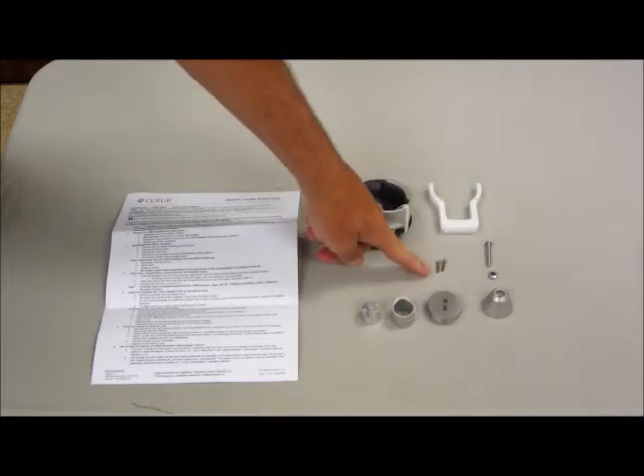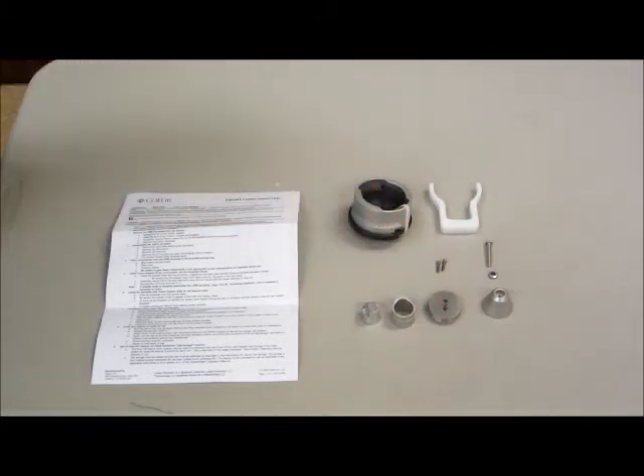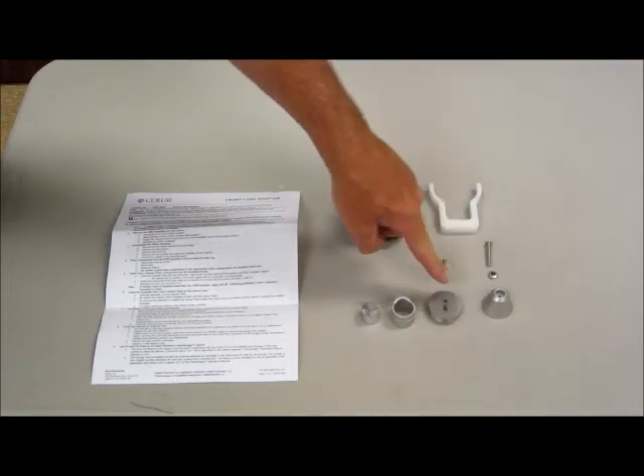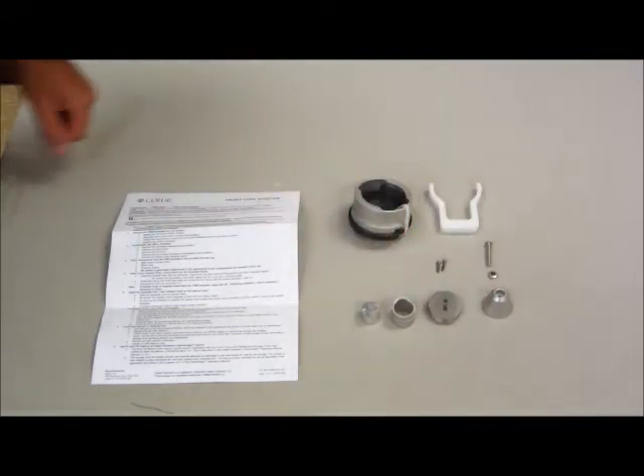These two small screws are to secure the RAM tip. They have a small amount of pre-applied Loctite on them, so you'll notice they'll be a little bit snug as you're tightening them. We also have this screw and washer, which are to attach the cone onto the RAM tip.